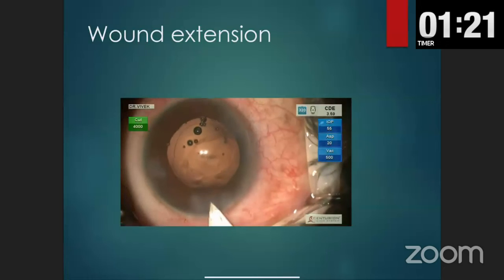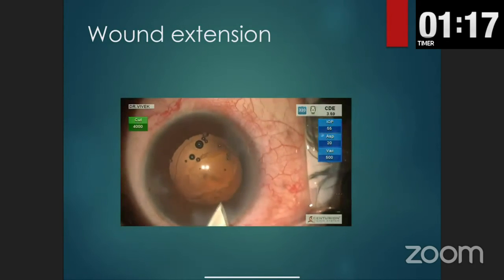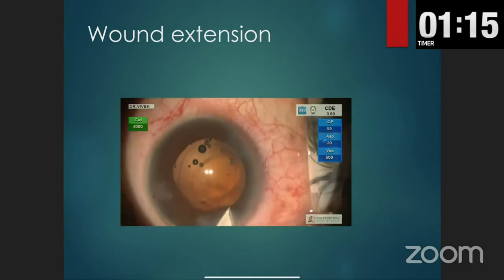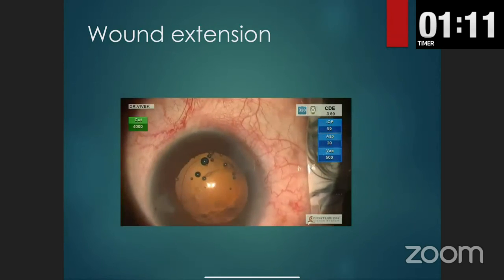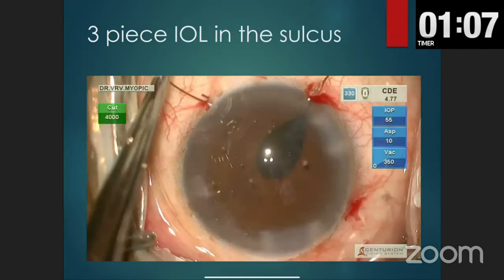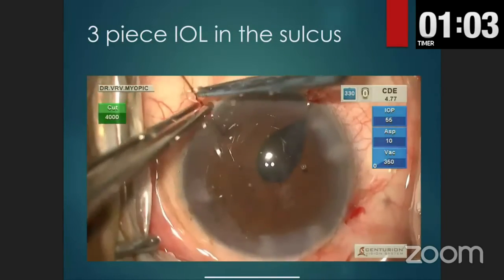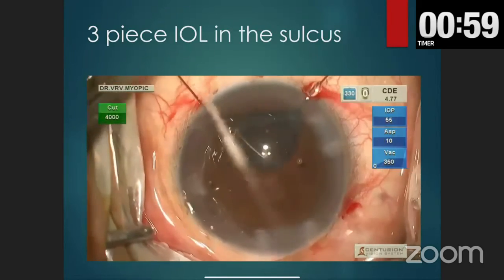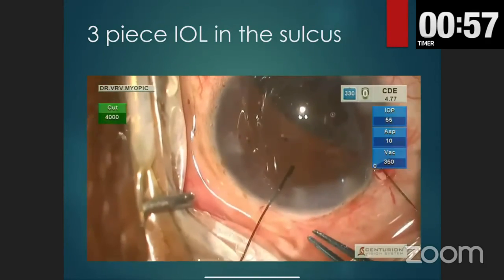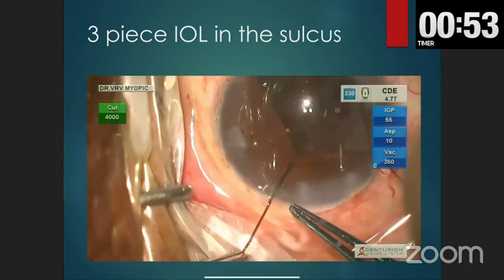This is one major thing. You should not cause any pressure. You shouldn't force the eye or squeeze the eye because you have an exposed vitreous and all that. So make sure you extend to 2.8 or 3 millimeter. Make sure you're comfortable and gently inject. And then the other thing, the same, like I said in SICS, don't hesitate, even at the end of surgery. Make sure you use iris hooks, have a proper visualization. So iris hooks are actually very good when you have a PCR.